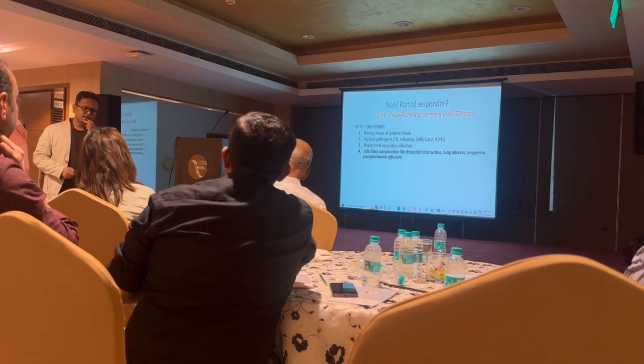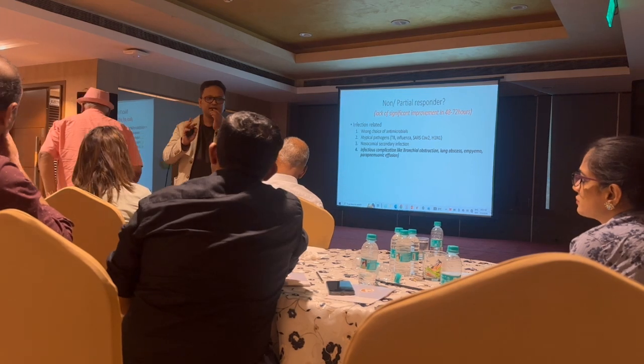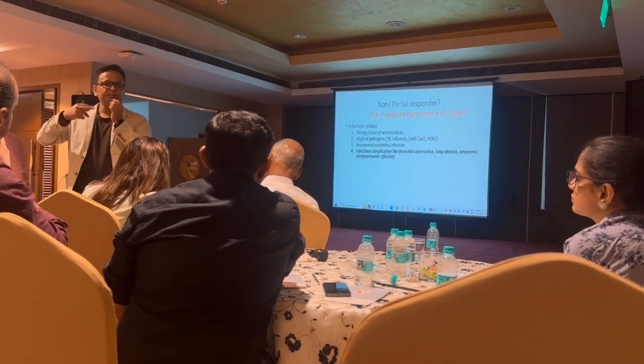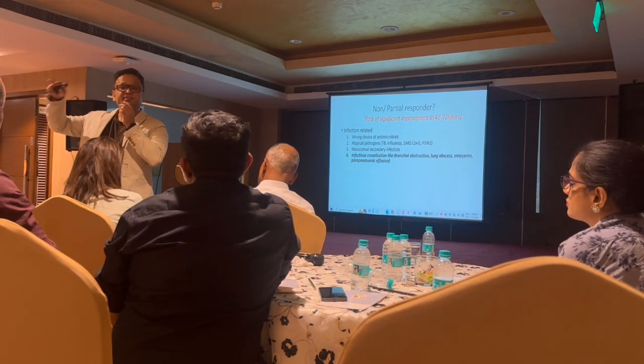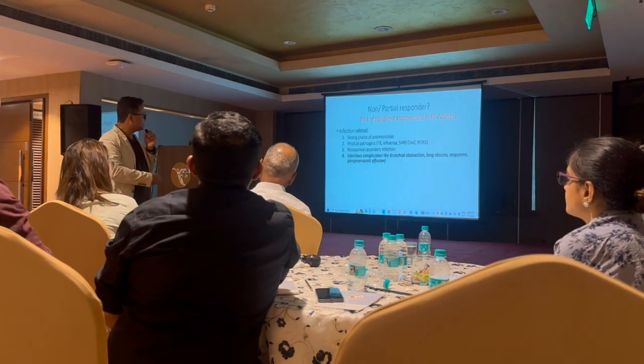Very important. See, when you're handling the patient, the man and the machine, don't forget the disease, please. You know, there are interesting numbers which you're seeing. But remember, the numbers are not improving not purely because of the ventilation issues, which are purely mechanical. There is a disease which is persistent, right? So you have to ask why my patient is not responding.